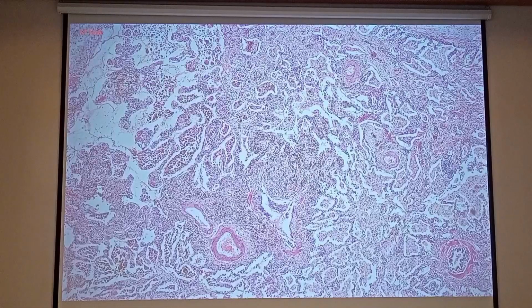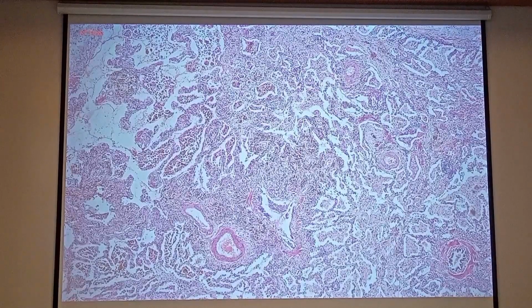Sorry, I cannot find that perfect example, but they look like that. Each one has a different configuration, but quite similar.